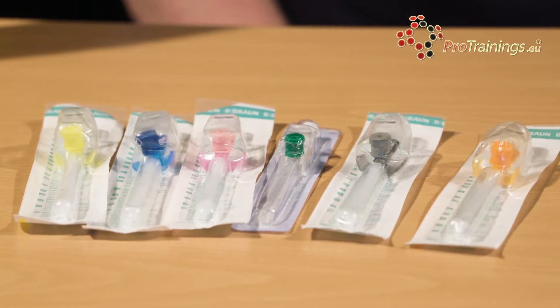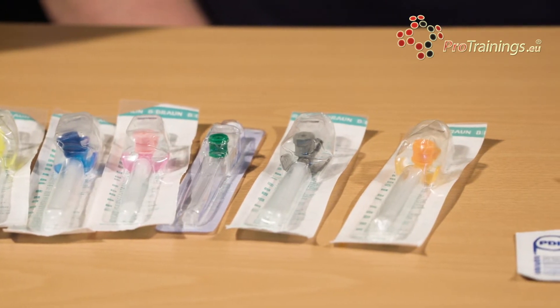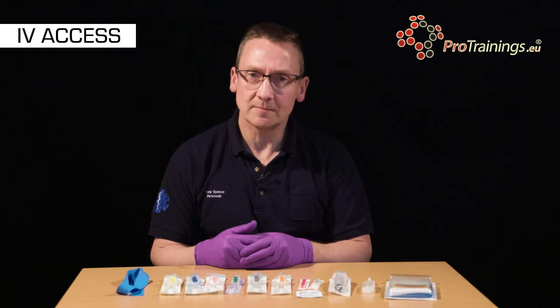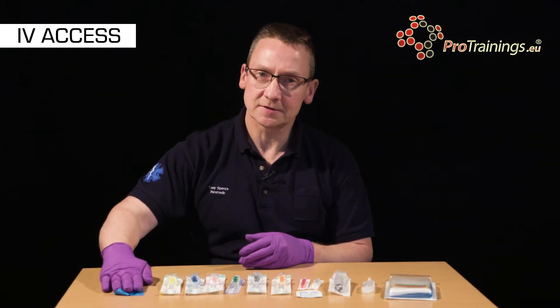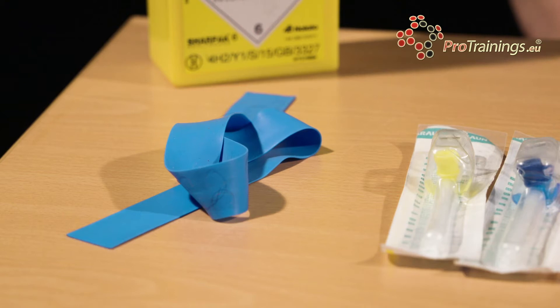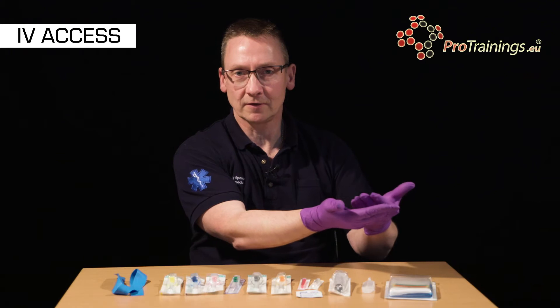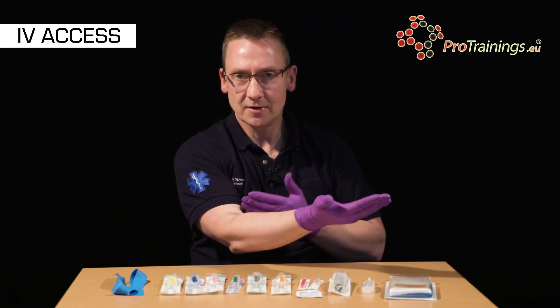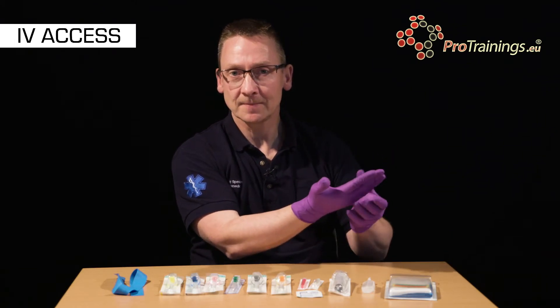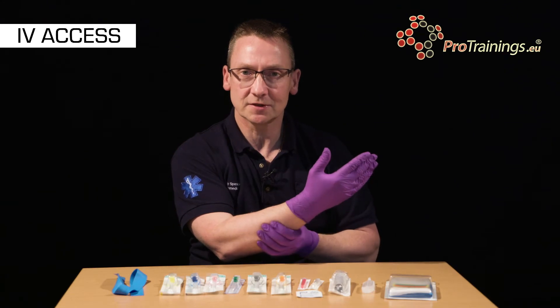Intravenous cannulas can be used for administering drugs and fluids to patients. In front of me here we have a range of equipment, starting with the tourniquet. We use this to pop around a patient's arm, tight enough to restrict the blood flow back from the arm but not tight enough to stop blood flow into the arm. In this way we'll get the veins to engorge and make access much easier.